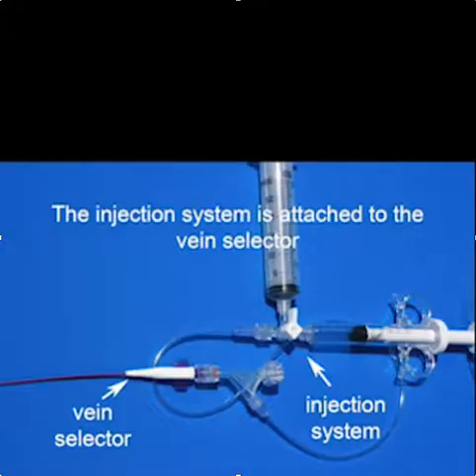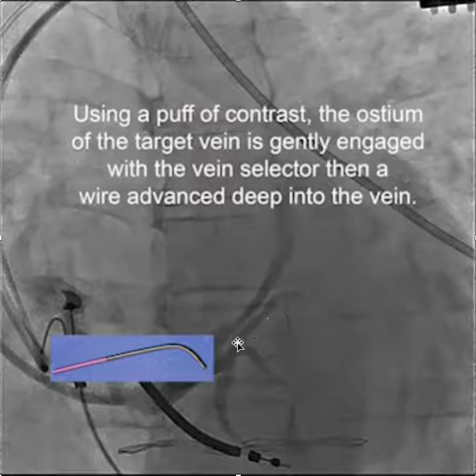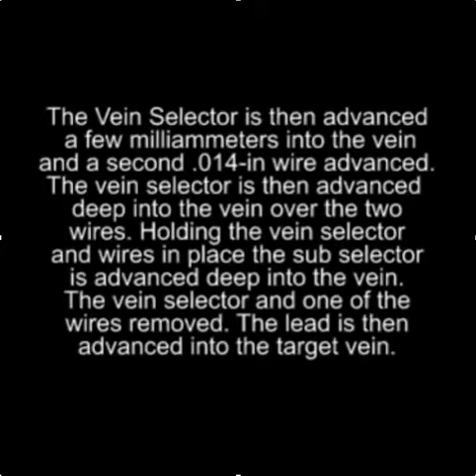And then, of course, we would attach the vein selector to the contrast injection system, and then go in and locate the ostium of this branch here with a puff of contrast, and then gently engage the ostium of the branch, and then advance a wire. And then once you get the first wire in, you would advance a second wire, again with the idea that you want to get your vein selector deep into the branch to serve as a rail over which to advance your subselector.